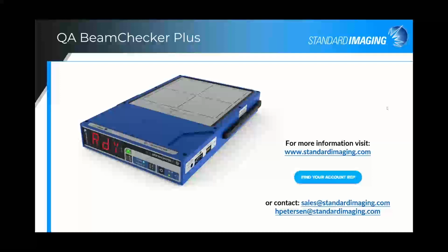That's how it works. We've got 3 different chambers with different buildup as part of the 8 chambers. So you've got 5 chambers in the cross pattern, and there are 3 chambers that are utilized for that automatic energy detection. So you do tell it what beam you're measuring initially for your baseline, but then going forward, it will recognize that beam and give you the results.